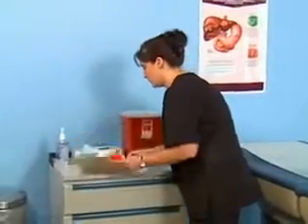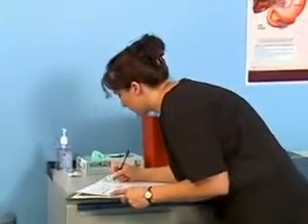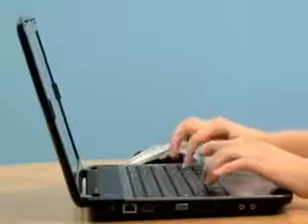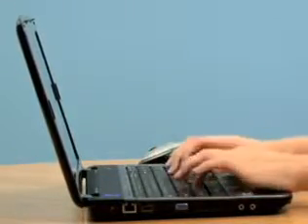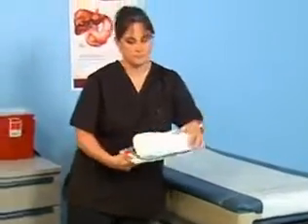Chart the procedure. Include the date and time, which arm and vein were used, and any unusual patient reactions. If you are employed at a medical office that uses an electronic medical record, chart the procedure by entering the appropriate data into the computer. Transport the tubes to an office laboratory work area.